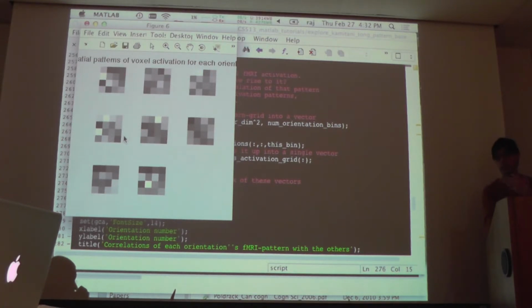But yeah, as you can imagine, these are much more complicated measures because, like you said, you have to encode the spatial information in there somehow. And then the question is, how do you encode that? And then you have different choices. So do you do a different pattern analysis when you keep it in a grid versus in a single vector? Is that what you're saying?